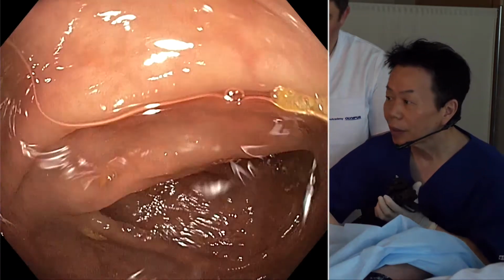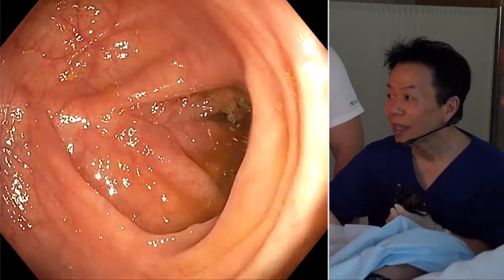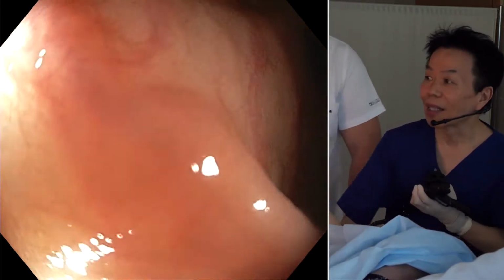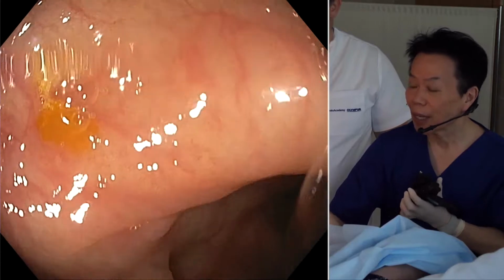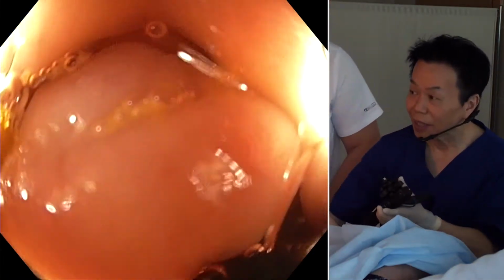When the colon is straight enough, the distance from the anal verge to the sigmoid descending junction is 25 to 30 centimeters, and the distance to the splenic flexure is about 40 centimeters, and hepatic flexure may be 60 to 70 centimeters. So would you change the patient position on her left side?